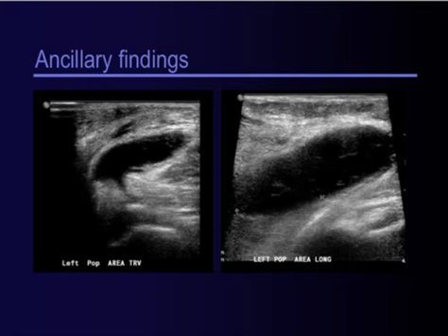It may be that the patient is post-op and you weren't informed of this information, and you may be looking at a seroma or a resolving hematoma. And again, in a very small population, you may be looking at a synovial sarcoma. So I think it would be very important that you're very strict about showing the landmarks to prove that you are looking at a Baker cyst.